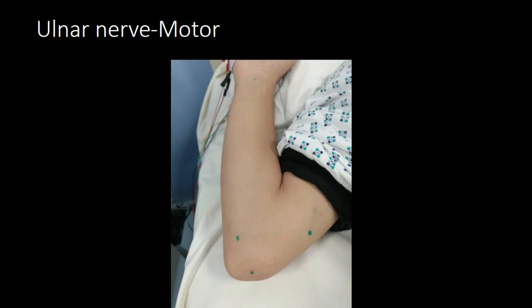So you need to bend the elbow like you can see in this particular case. You're going to go like this for below elbow and above elbow. Okay. Try not to go too high up. Keep these two stimulating points within 10 centimeters.